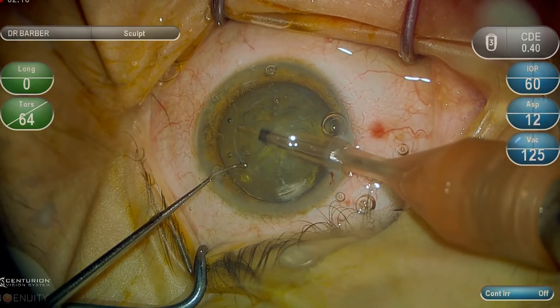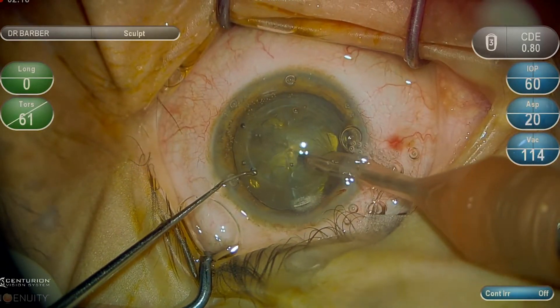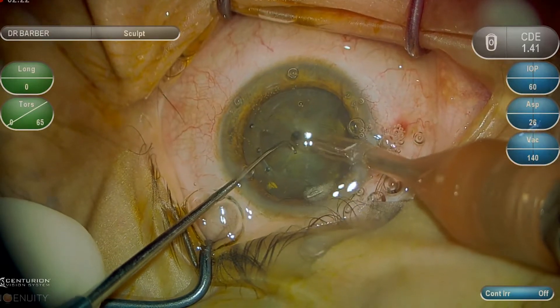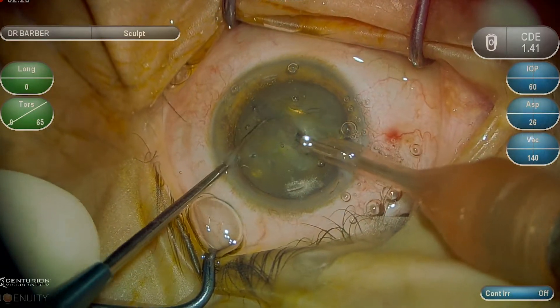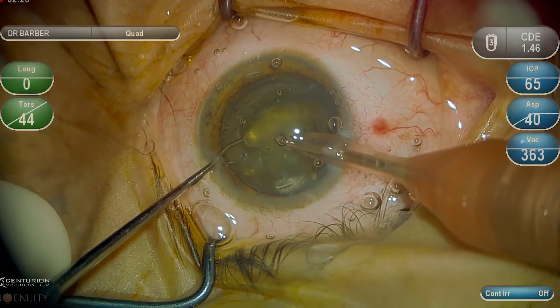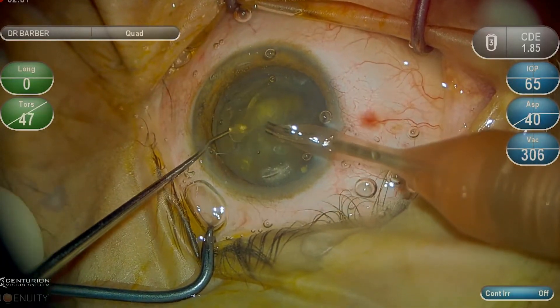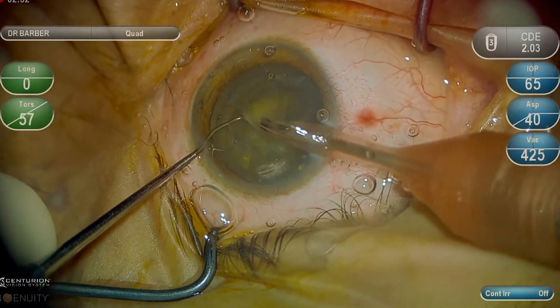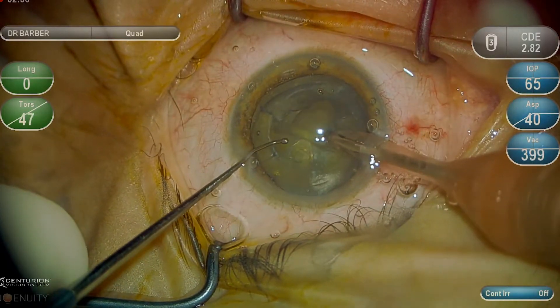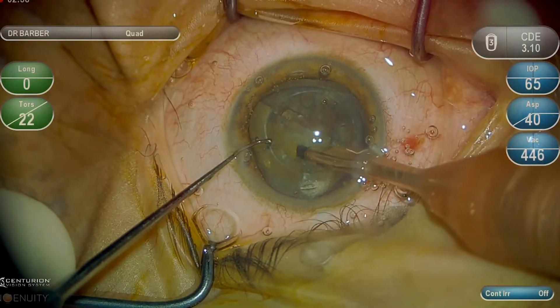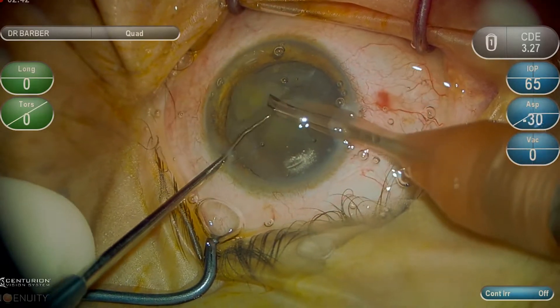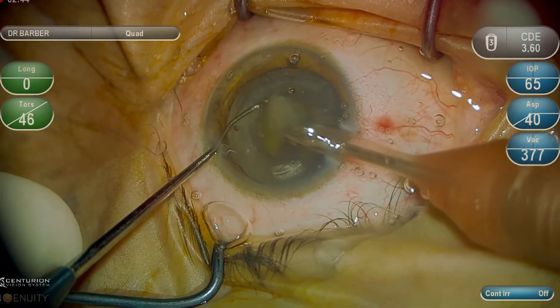This nucleus is easily cracked in half, and then using the stop-and-chop technique, the remainder of the nucleus is phacoemulsified and aspirated. As the nucleus is being removed, the lack of a red reflex becomes more and more apparent.